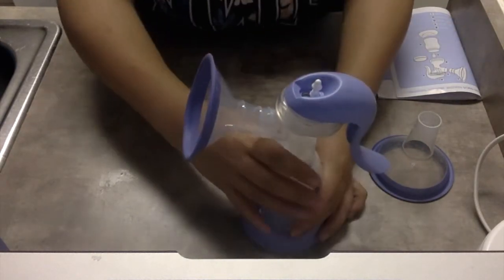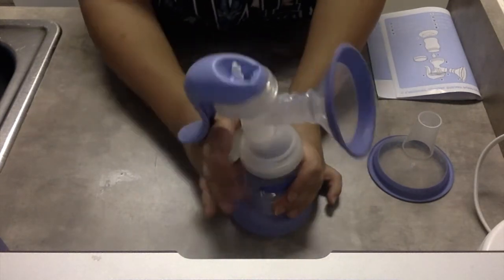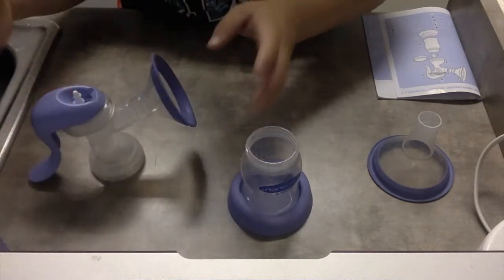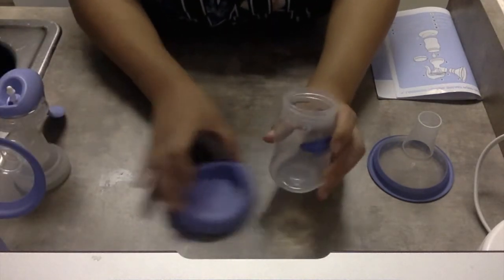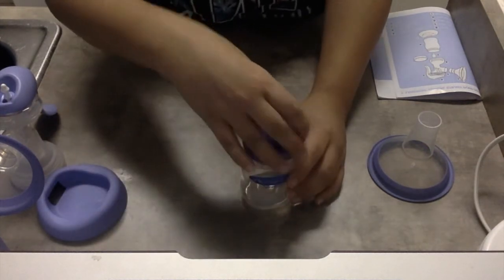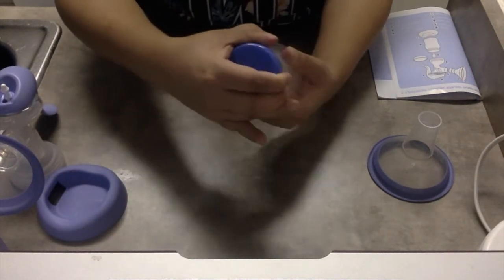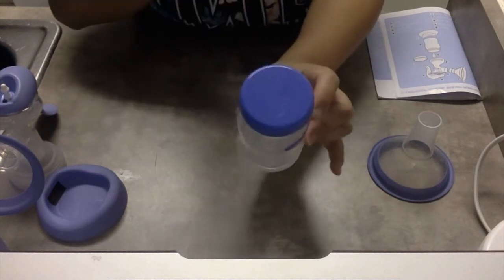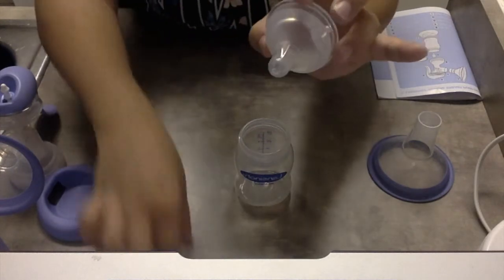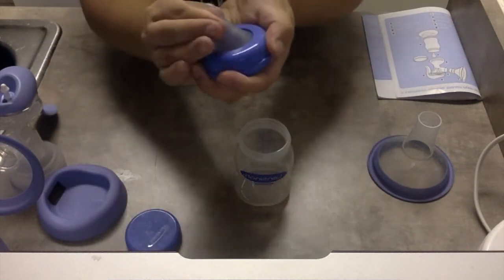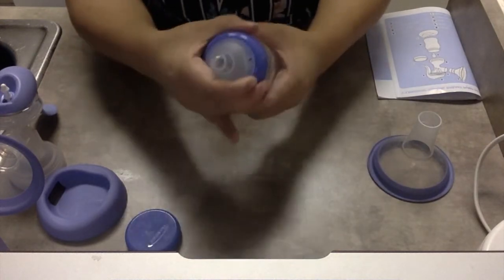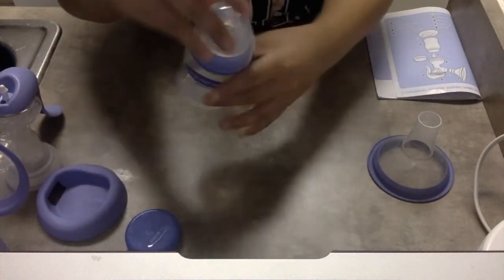And then once you're done, you unscrew the big part. You want to set that aside somewhere. It is pretty big. You can take this out. And then if you want to just store it in the fridge for later or just in your diaper bag for later, it comes with a lid that just closes it all the way. Or it does come with a nipple and a collar and you can just put this in. This is like the Medela bottle if you're ready to feed your baby.